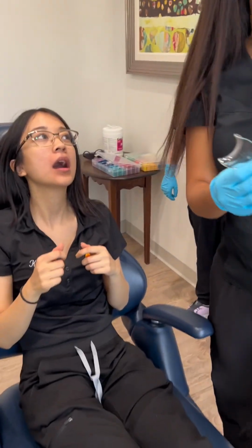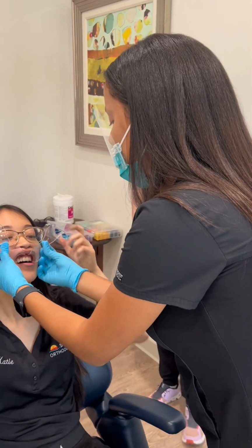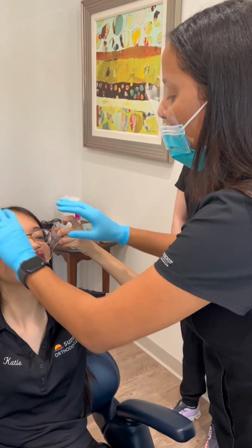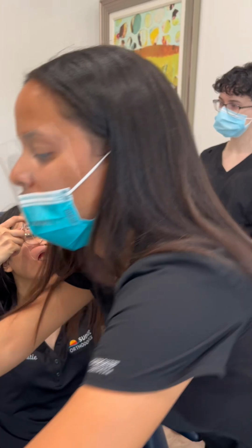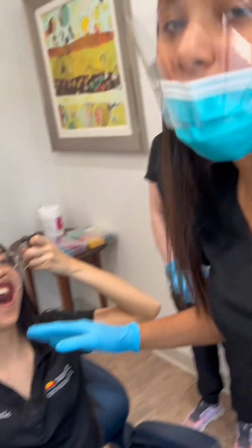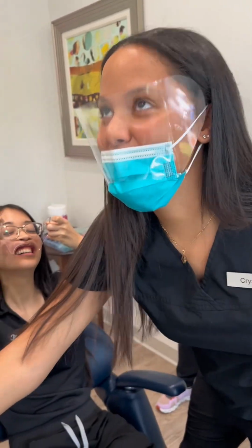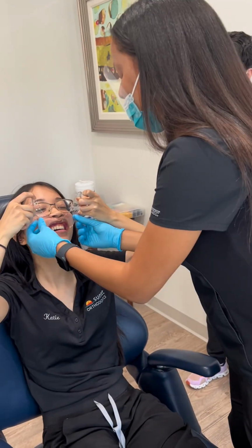Oh, I hit my head with that a lot. It's part of being a dental assistant. All right. And you're going to hold these up. You're going to have the patient hold them up, and you're just, can you hold these up for me? Because I know her, that's why I'm not doing all of this, but I should probably be doing it like I don't know her.